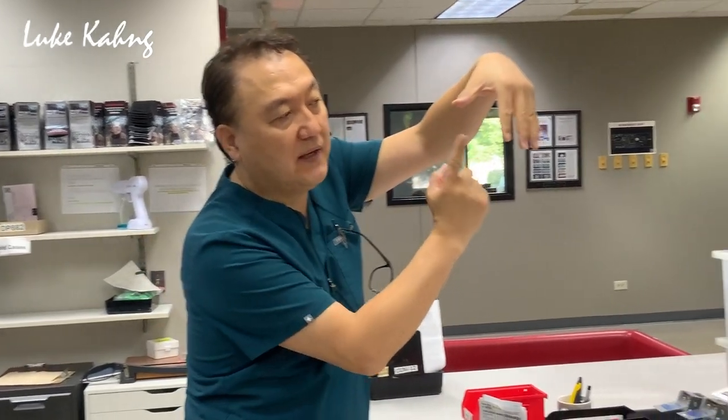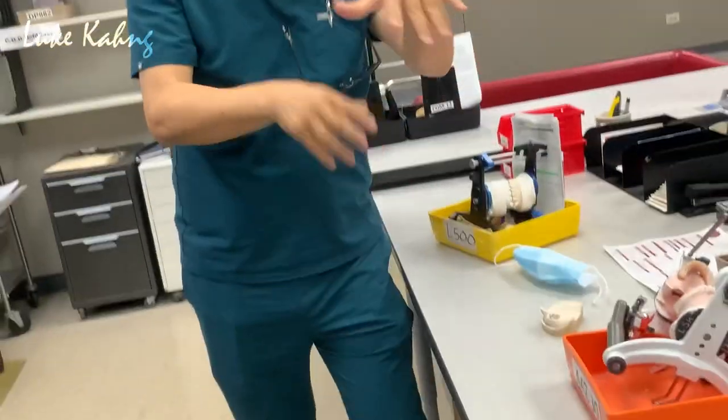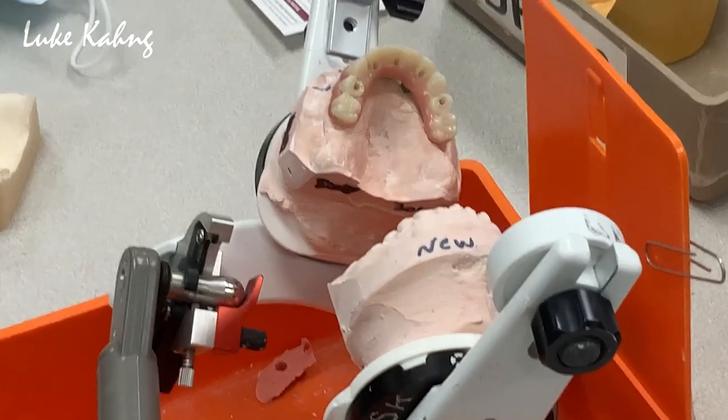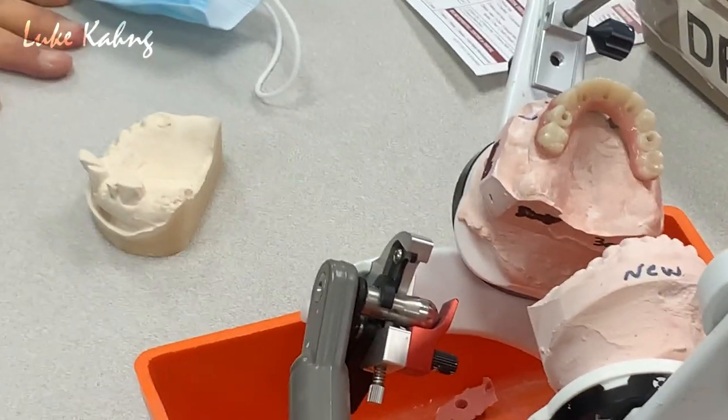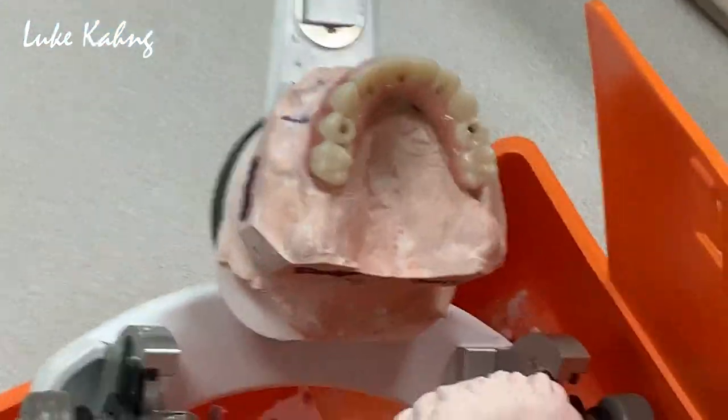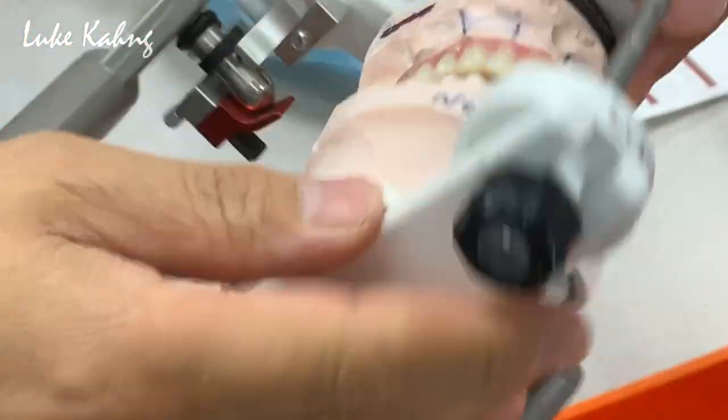I'm a ceramist. So between the ceramist and the removable technician, the removable technician sets up with an open anterior position for the denture. I'm not talking about that one. I'm talking about the final fixed restoration. The number one issue is that the denture technician's setting is in the wrong direction. It's wrong. I don't know, maybe dentists give it to them, I don't know exactly. So whatever they do with the open setup, that's not right.